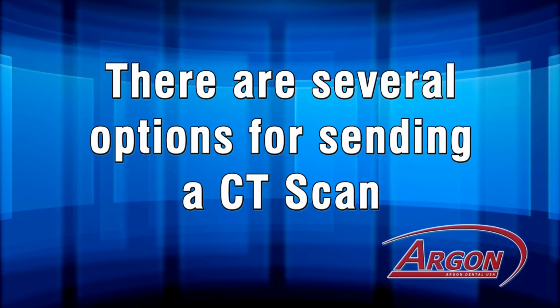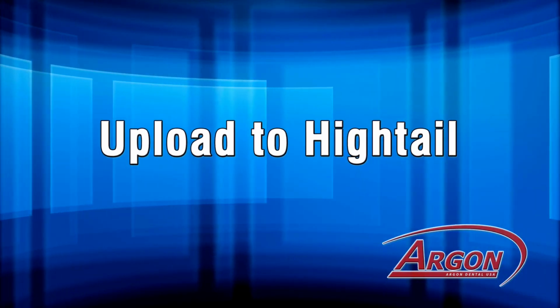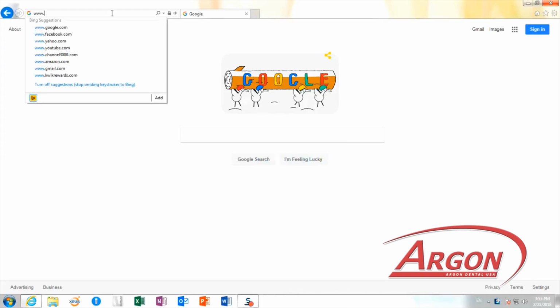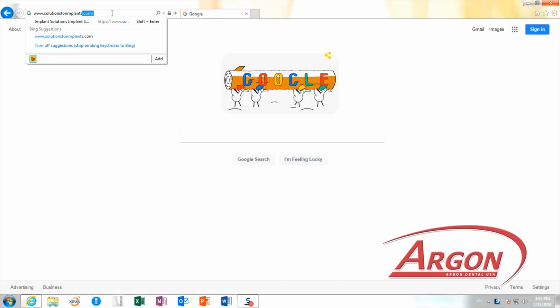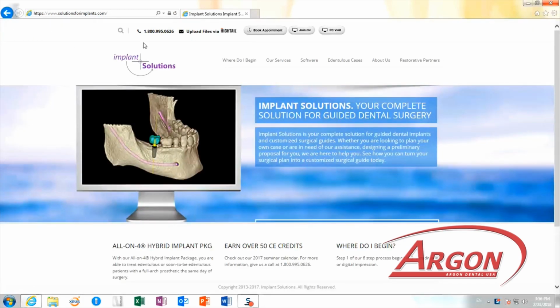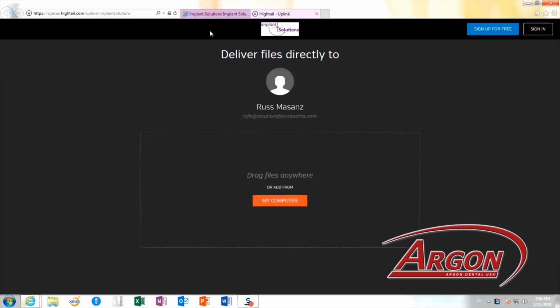When exporting your CT scan, you have a few options. One of them is exporting using the Hightail through the Implant Solutions website. The Implant Solutions website you will see on your screen, www.solutionsforimplants.com. You will find the upload files via Hightail. Click on the link and select the file from your computer.